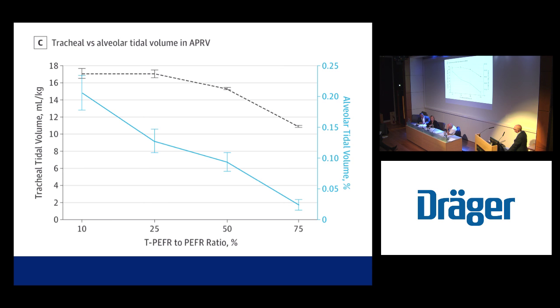Also, the T-low is extremely important, because if it's not set correctly, then you may see larger tidal volume at the ventilator, and it's actually analogous to decreasing your PEEP if it's set too long. So those things are very important. So the second issue was? The second issue, yes. Am I concerned about this 900 milliliter tidal volume?